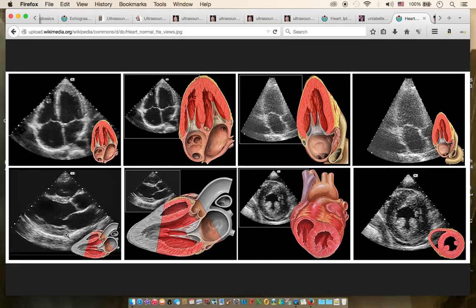And I will discuss later on in the video how to assess or judge whether the patient has a very good left ventricular function or not, because the interventricular septum and the posterior wall of the left ventricle contract simultaneously in a synchronized manner, and the ventricular cavity will narrow. This is during systole. During diastole, the ventricle will come back again to the normal size. Okay, now let's go to the video and see the videos.